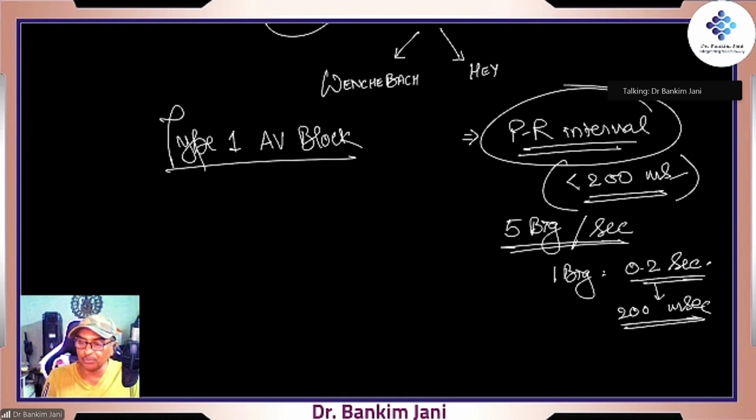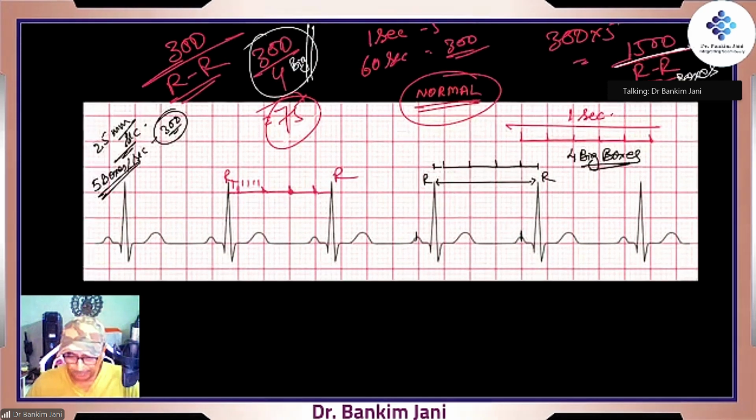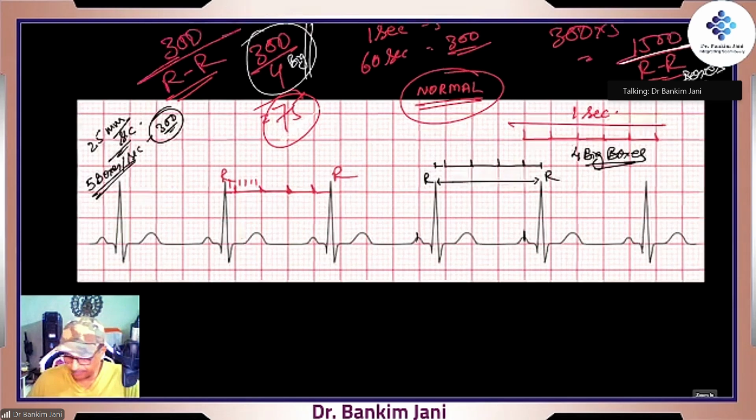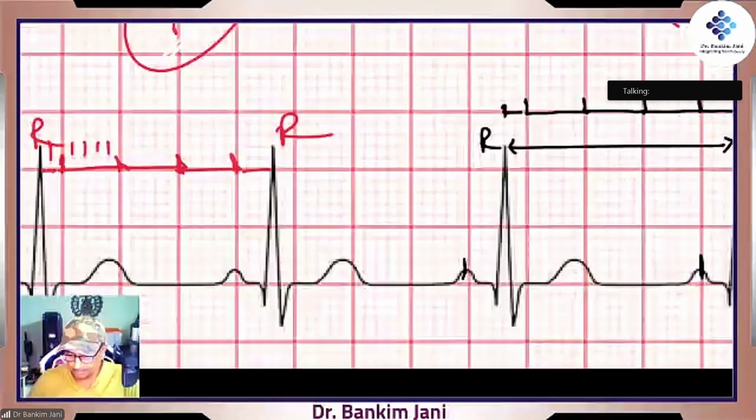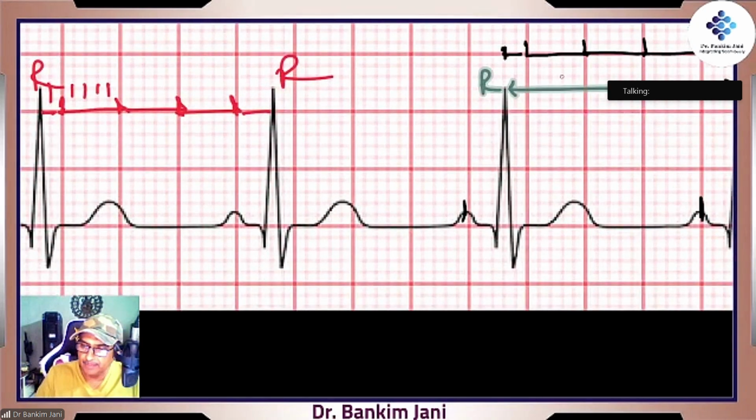Now let's go to that ECG to understand this concept, because this is slightly a misnomer. Misnomer means that what is mentioned as PR, actually it is not PR. Right? So you just see that, and I'll tell you the reason also why it is. Okay, I'll just zoom this. I'm erasing it, because we have already understood it.